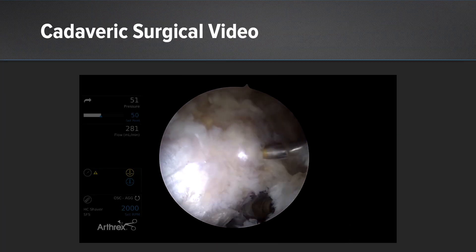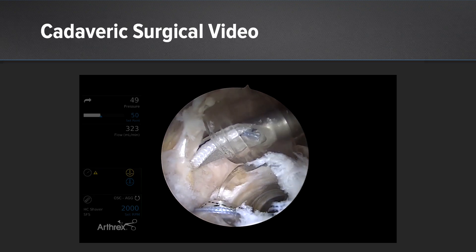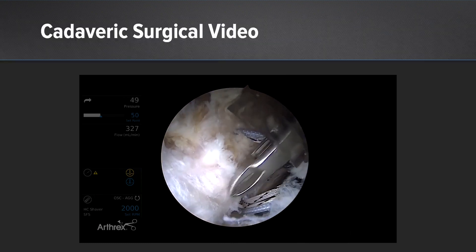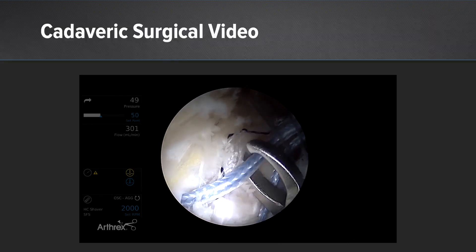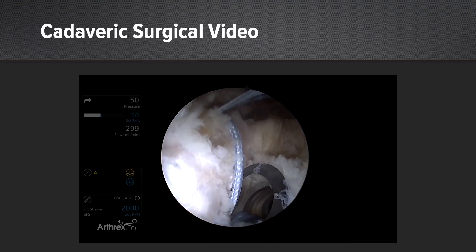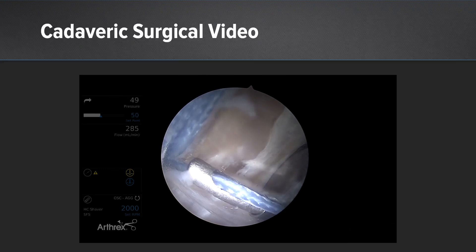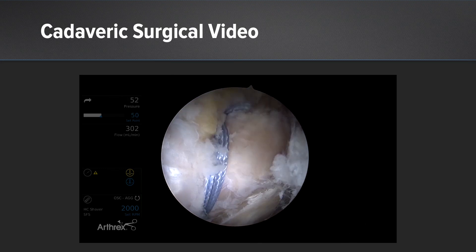This is a cadaveric video by Dr. Dome showing him micropuncturing the area to be repaired. He then puts in his knotless fiber tacks. He's now crossing the sutures — the repair stitch — taking the anterior one to the posterior and the posterior one to the anterior. He then puts it through the looped end of the shuttle suture, pulls it down nice and tight, and you get a nice compression of that tendon tissue just below. Use your cutter and you've got a nice compression bridge.